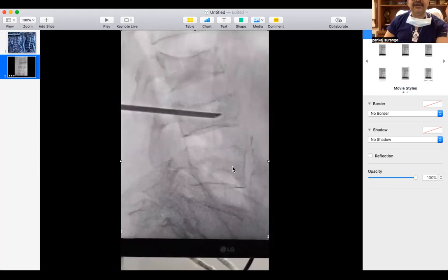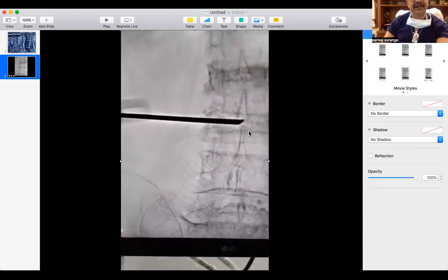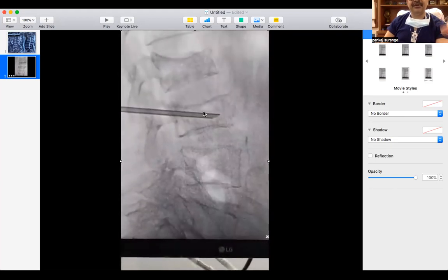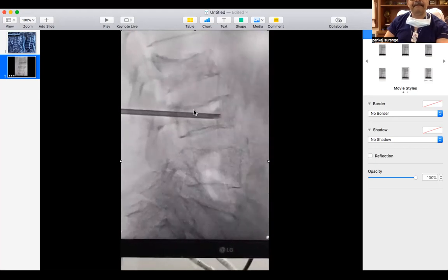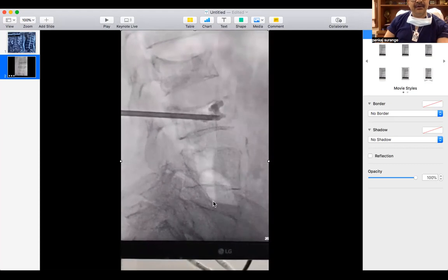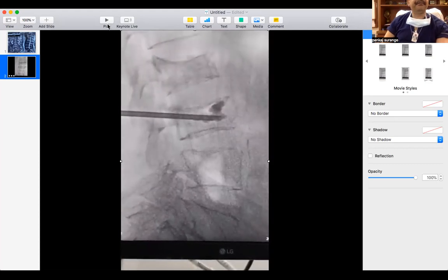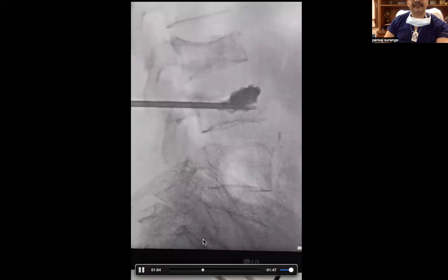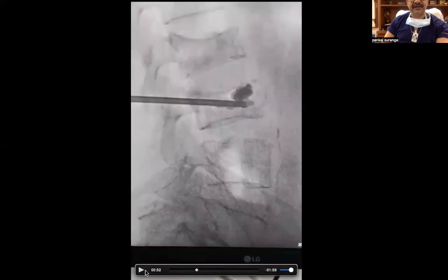So we start going like this, deliberately keeping my bevel downwards, so that the cement should not directly go into this cleft. Now we start injecting the cement. And now you can see here, this is where we started filling the cleft. You can see here, that's the cleft.